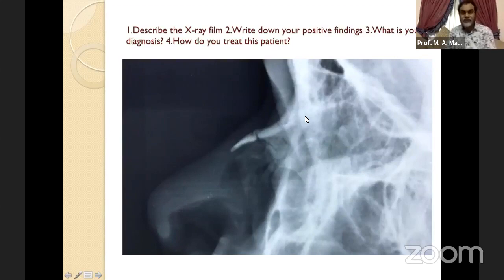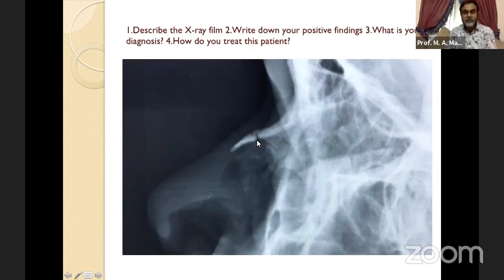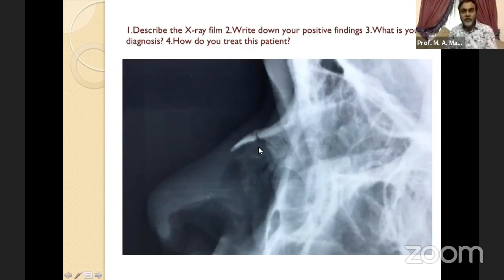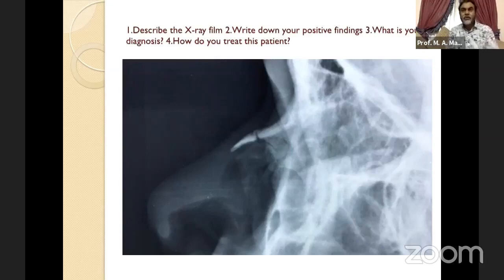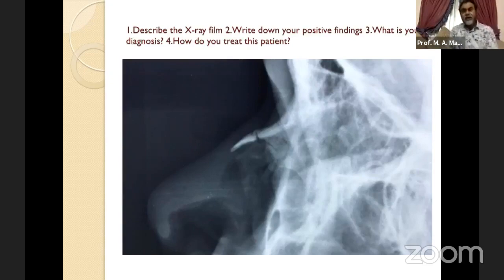The finding shows a fracture in the nasal bone with no displacement. There is a tear or fracture at the mid part of the nasal bones but no displacement. Diagnosis: fracture nasal bone. Treatment: the patient needs manipulation of the fractured bone by digital pressure — manipulation under local anesthesia, or under general anesthesia with digital pressure.